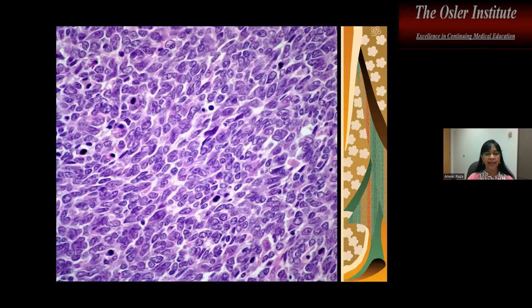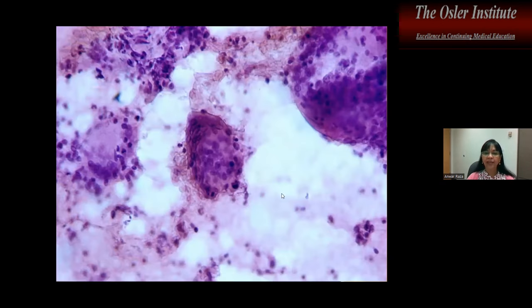And then again, this is the histology for small cell carcinoma, a lot of mitoses, high NC ratio, coarsely granular chromatin, so salt and pepper chromatin pattern, so small cell carcinoma. This, on the other hand, just by looking at this, you know that these are giant cells, right? You see lots and lots of nuclei. So this is a multinucleated giant cells here, here, and here.